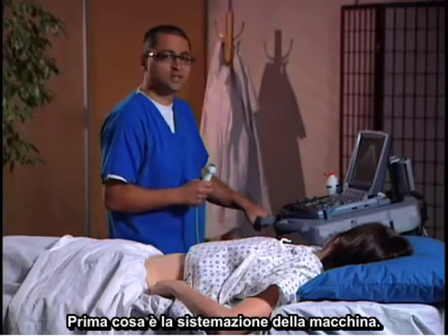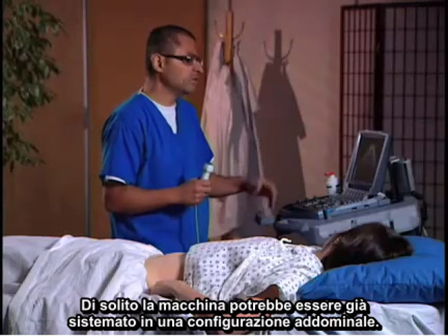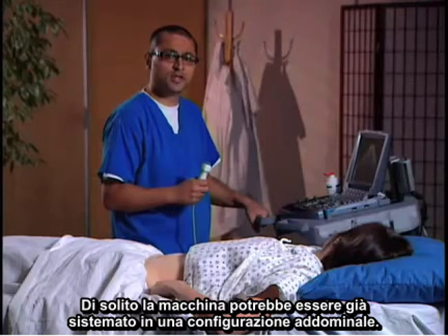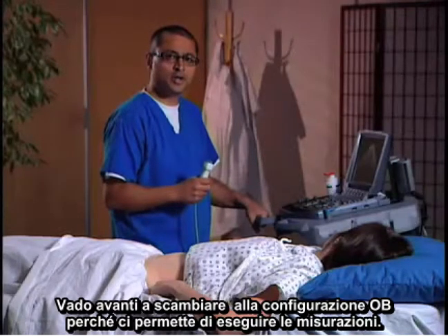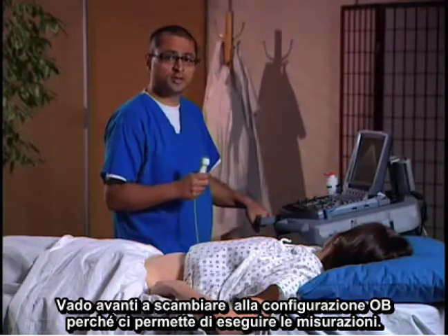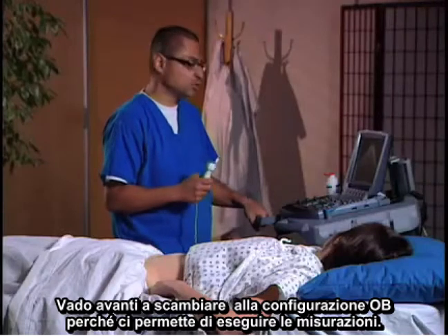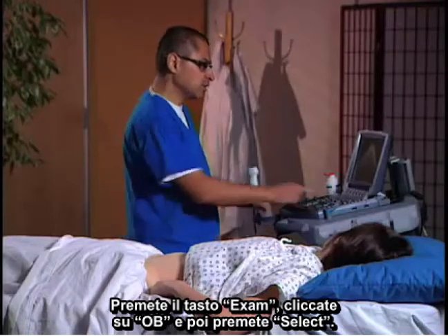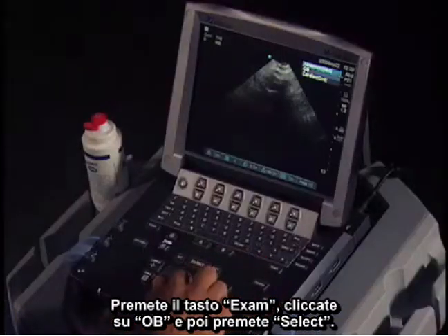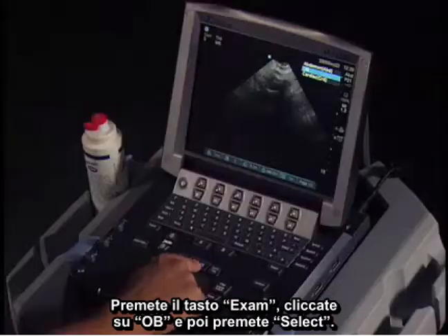First, machine setup. Commonly, the machine may have already been set up in an abdominal configuration. I'm going to switch to the OB configuration because it allows us to do measurements as well. I'll hit the exam key, click on OB, and then hit select.